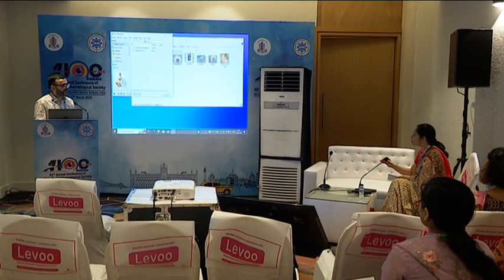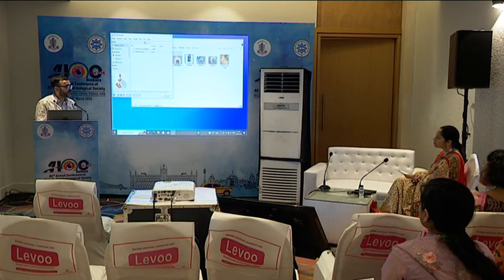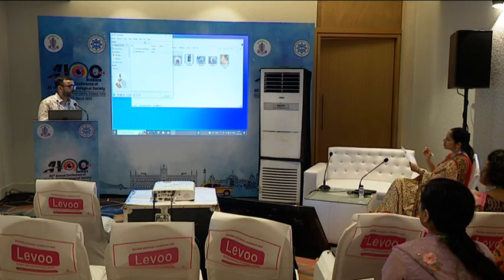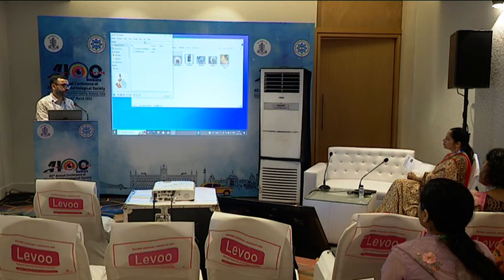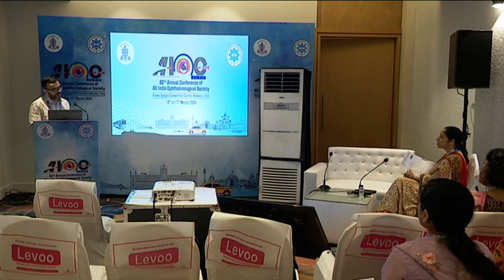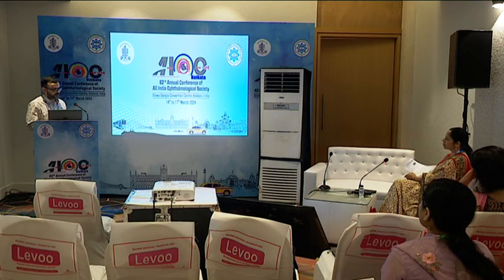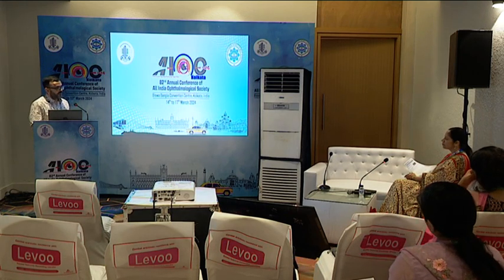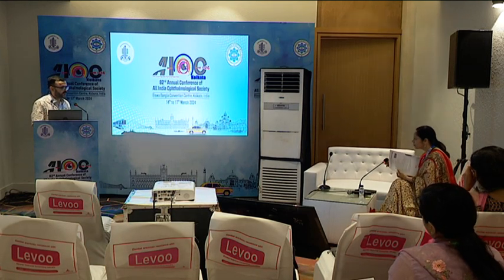Can you predict what patients have high chances of getting zonular dialysis during surgery? Can you predict it before surgery? In what patients do you expect higher chances of zonular dialysis? If we see the bag is weak, beforehand there is some movement of the lens. Apart from phacodonesis, any other? There is pseudoexfoliation, and hard cataract, hypermature cataract. Thank you.